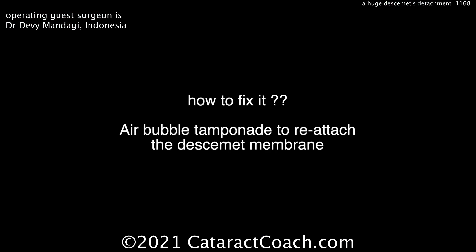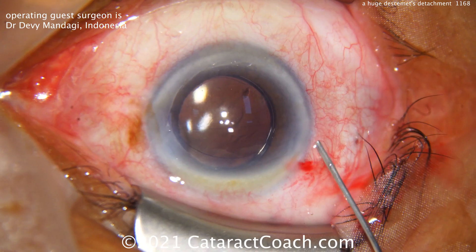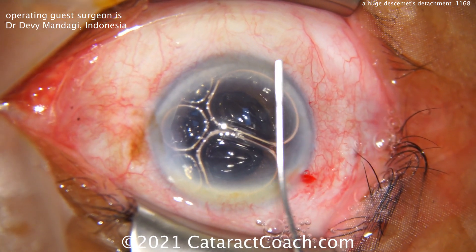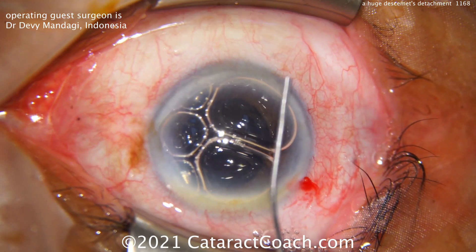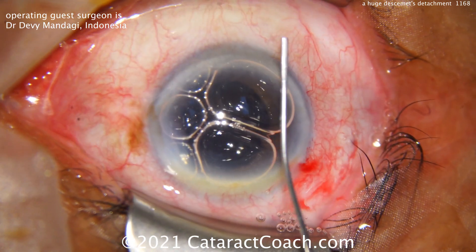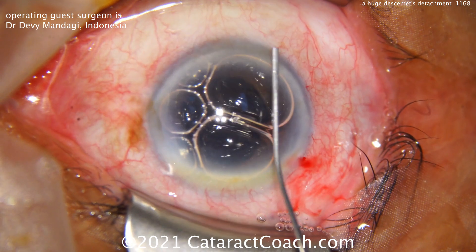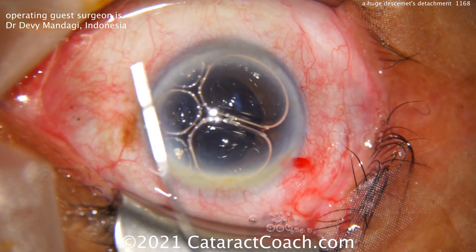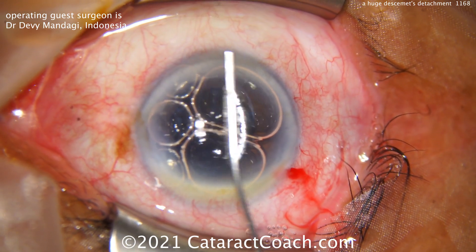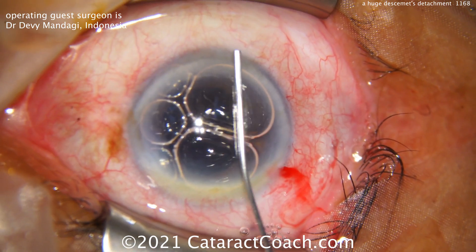Now, should you finish the case here? That's a good question. Putting the lens in right now and continuing the case may cause a bigger detachment, so maybe the better part of judgment is: let's first tamponade this and get it back into position. You can always come back in a few days or a week to put the lens in. Thanks for sending me the video — I really appreciate it. A very unusual case that I hope you don't encounter too often.